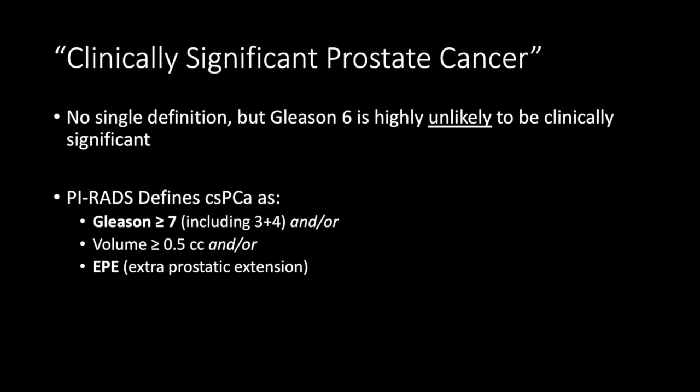And what is interesting is that prostate MRI is actually pretty good at identifying clinically significant prostate cancer with sensitivities and specificities around 80% in the literature. So that brings us to prostate MRI. And I don't want to go through a whole history lesson here, but essentially prostate MRI used to really only be used for staging in patients with known cancer.